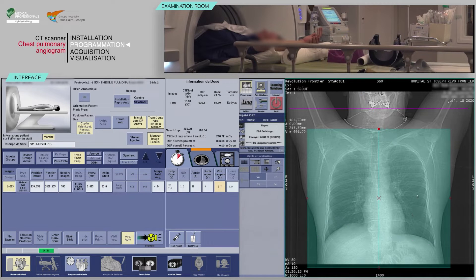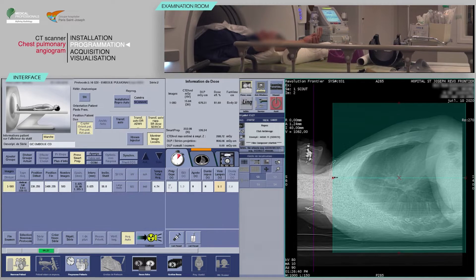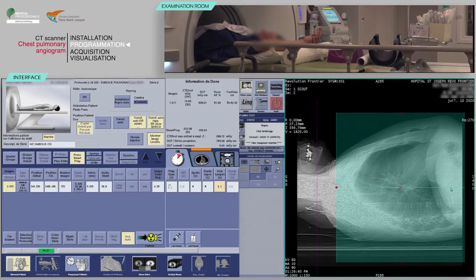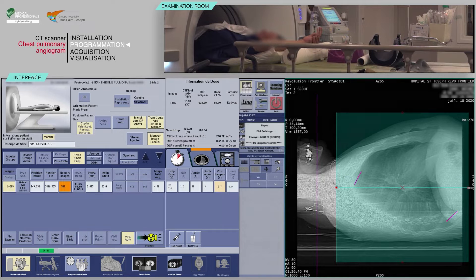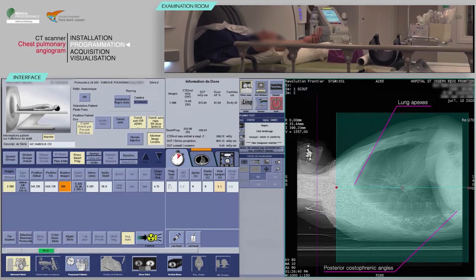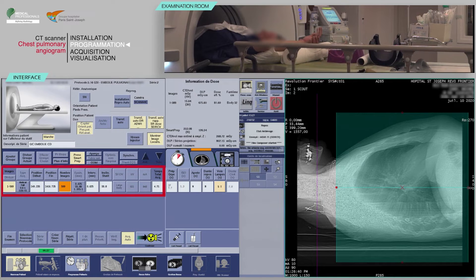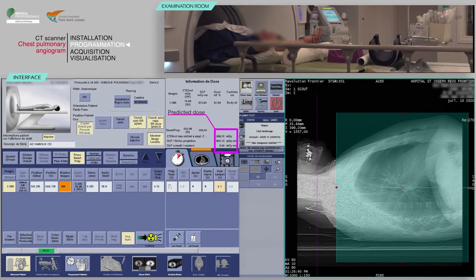On the lateral scout view, check that the location of the slices box is at the mid-thickness of the patient. The scan area should be extended from the lung apices to the posterior costophrenic angles. Verify the consistency of acquisition parameters, which are often pre-configured. Before continuing, check that the predicted dose is consistent with the diagnostic guideline values.